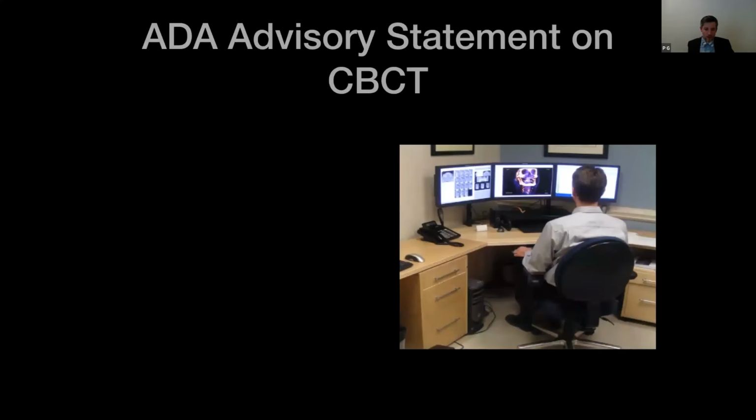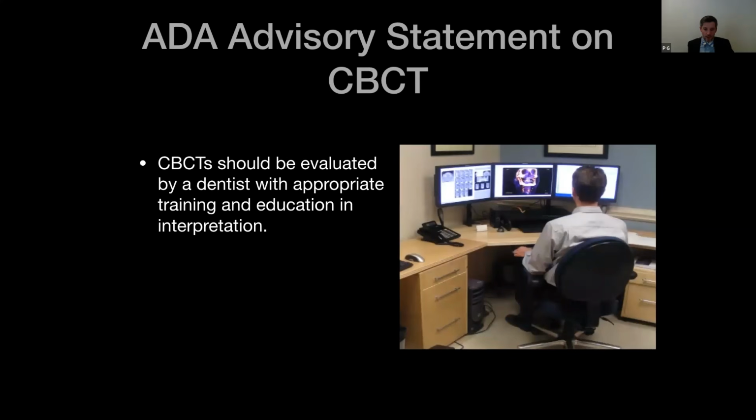First off, they do suggest that you get some amount of education or training on CBCTs. So that might be part of the reason why you're tuning in tonight. And I know some of you who may not own a Planmeca cone beam, most manufacturers should hopefully provide some sort of education. And again, we just completely revamped the new cone beam course for Planmeca that's held in Chicago.